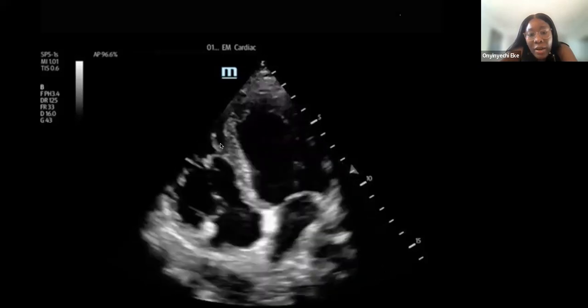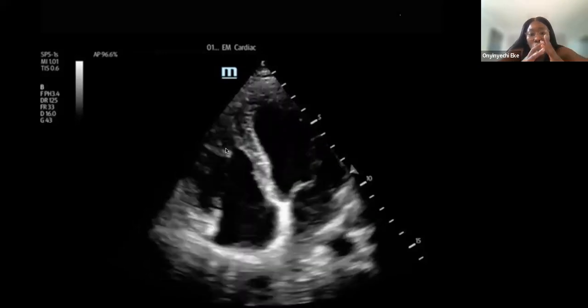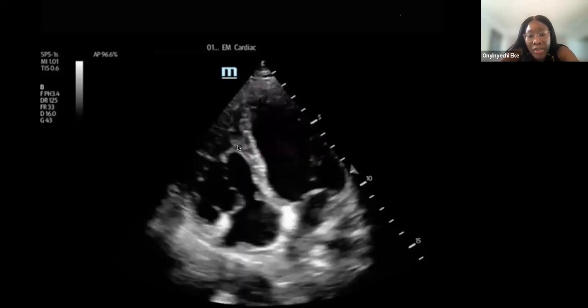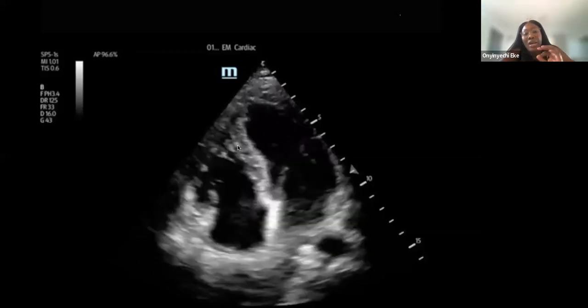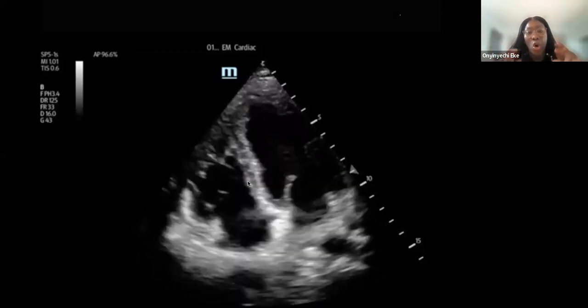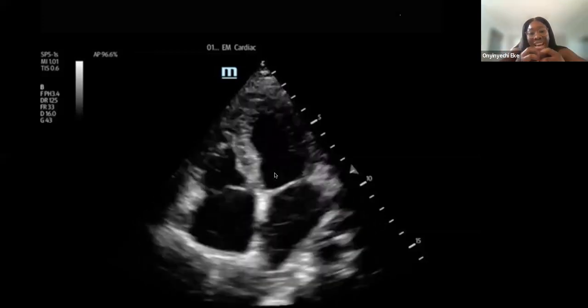Inside the right ventricle, there's a lot of trabeculations. We have this moderator band that goes across. That's only found in the right ventricle. We can also look at the squeeze. The right ventricle, the way it squeezes is longitudinally. It goes up and then down. The left ventricle, it goes inwards and outwards.